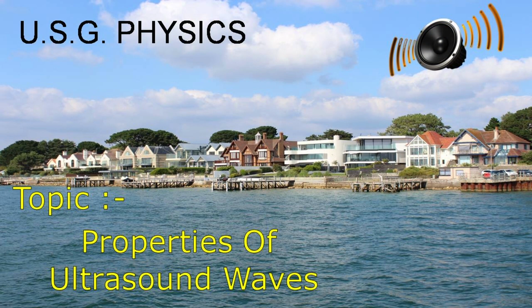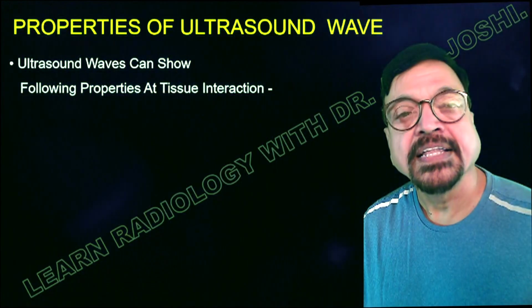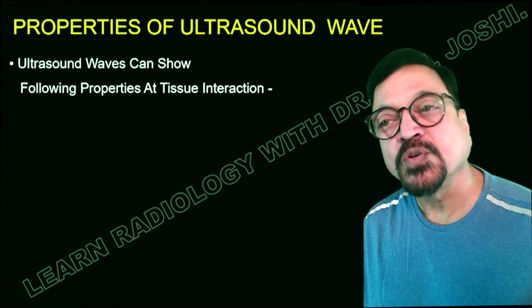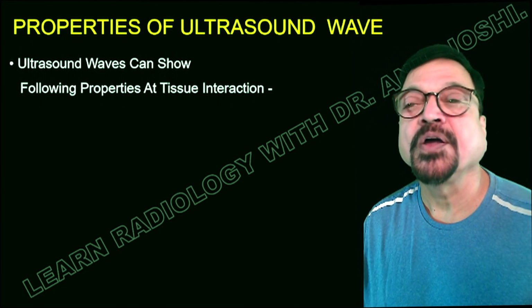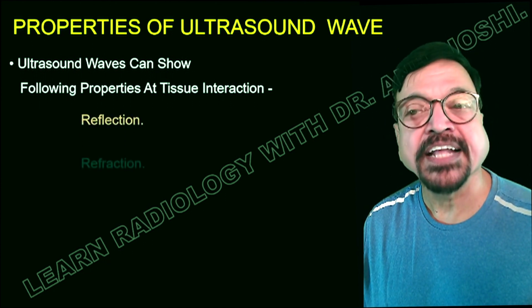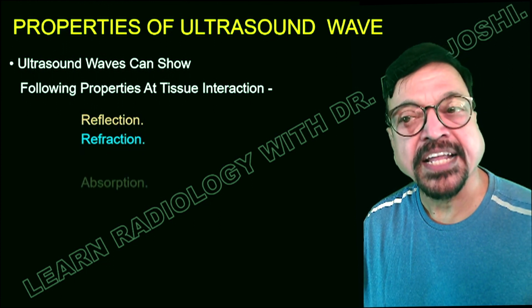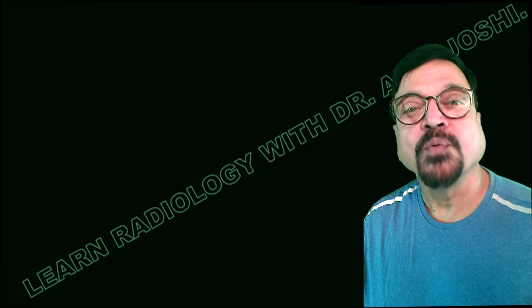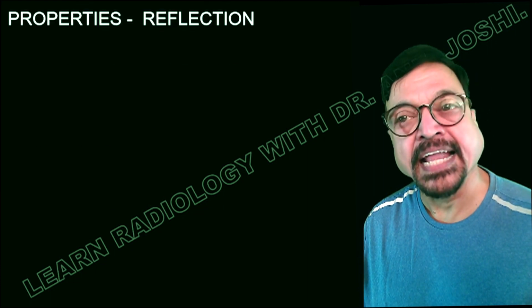Now coming back to today's topic of ultrasound physics, that is, properties of ultrasound waves. Let's consider different properties of ultrasound waves. Ultrasound waves can show the following properties at tissue interaction: reflection, refraction, absorption and attenuation. Now we'll see each of them in detail.